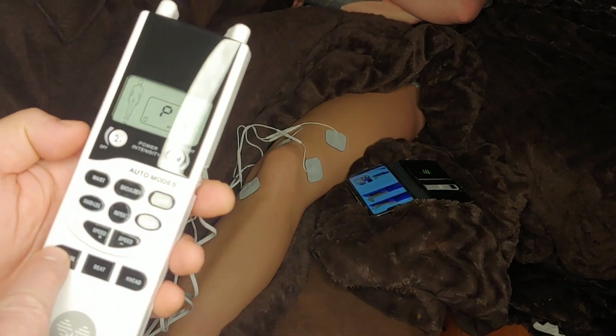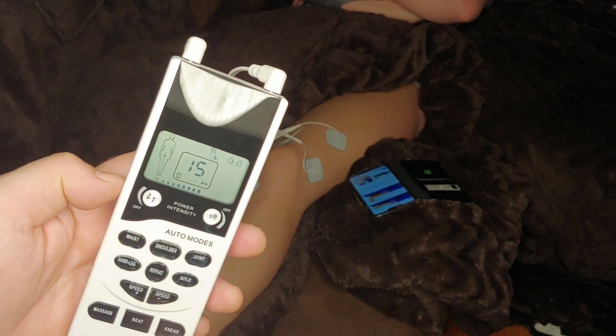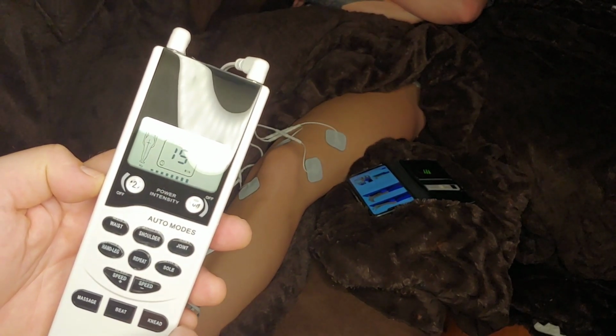And we're going to push massage. Now, the thing I noticed is it goes to 15 right there, and that's a 15 minute timer. So it'll automatically cut off for you after 15 minutes. All right, so do you want more? All right, we're going up to 2.